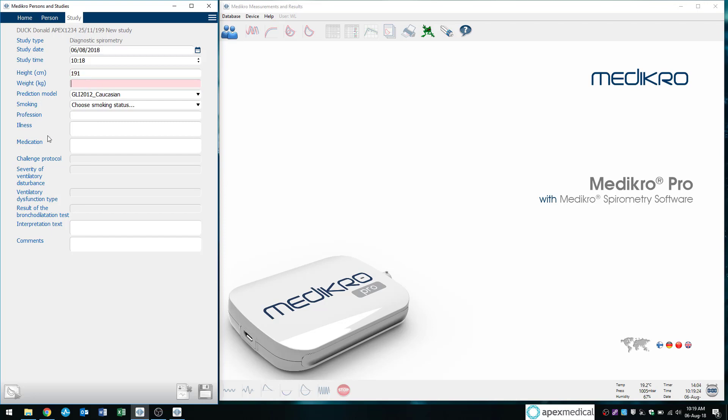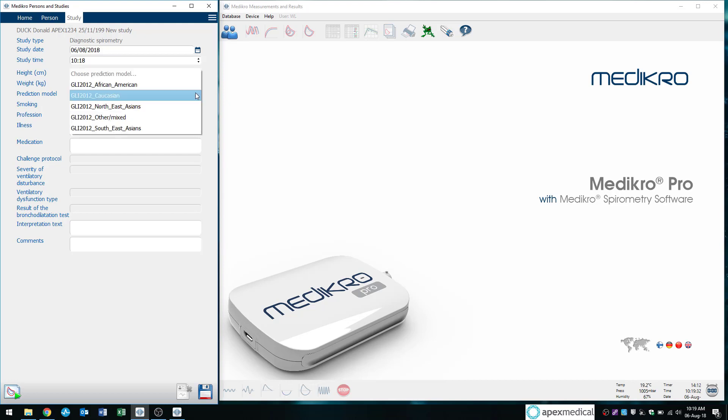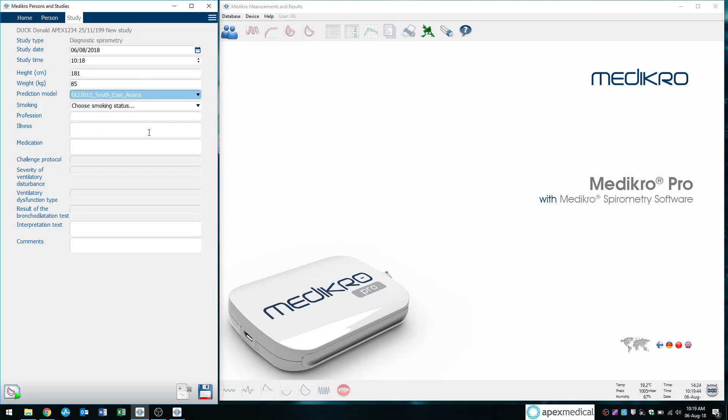So I'll put in my height. Oops, I'm not that tall. And my weight. And also very important to pick a prediction model. And the prediction model you want to pick is the one which relates most to the patient. Always ask the patient regarding their ethnicity.